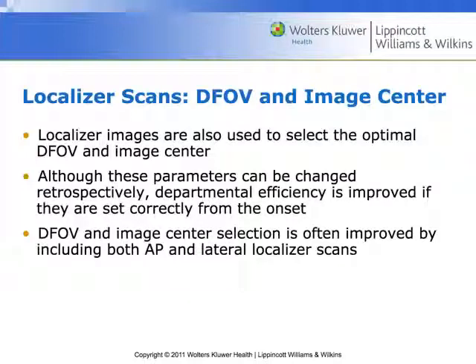And particularly one of the things that I think is helpful 99.9% of the time is skin margin. If I can visualize the patient's skin margin, then I know, okay, if I'm scanning an abdomen, there's not a hernia outside of the area that I've got on these pictures. Or if I'm looking at a cancer patient, there's not an axillary lymph node that's inflamed that's outside of the area that I'm scanning. So skin margin is helpful.